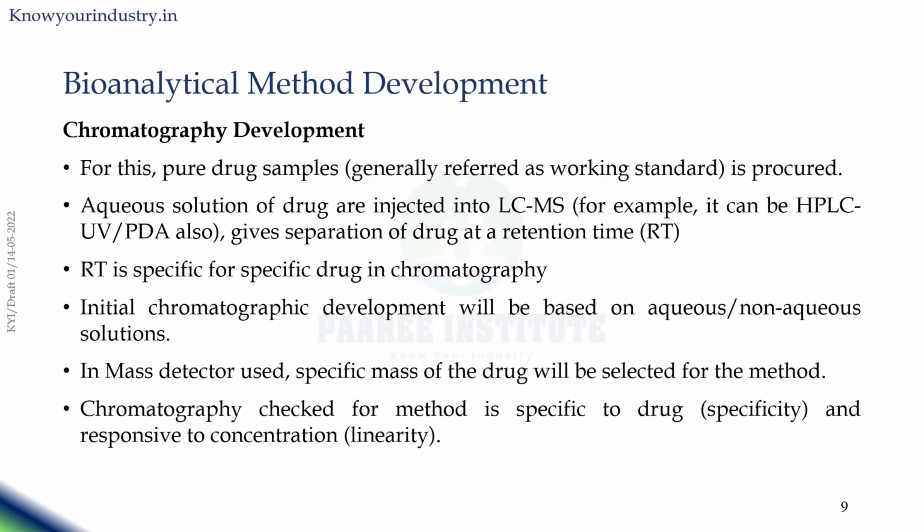For this purpose, we procure the pure drug samples, called the working standard or the active pharmaceutical ingredient, qualified for the purpose of bioanalysis. So pure drug samples, generally referred to as the working standard, will be procured for bioanalytical method development. Then the aqueous solution of the drug, or non-aqueous solutions like methanol, methanolic water, or many combinations of these solvents, can be used as a diluent for dissolving the drug and injecting it into the LCMS.